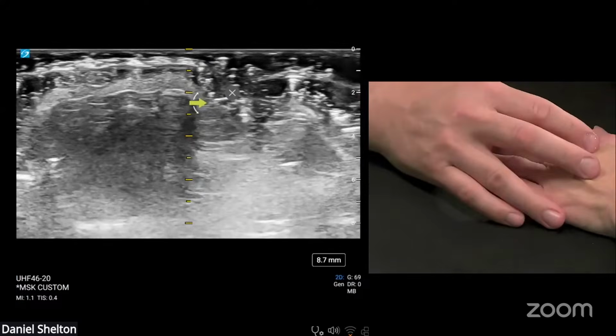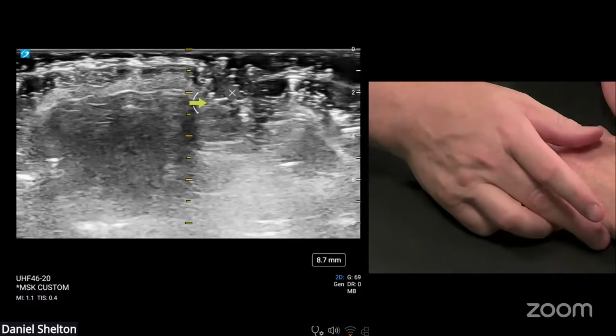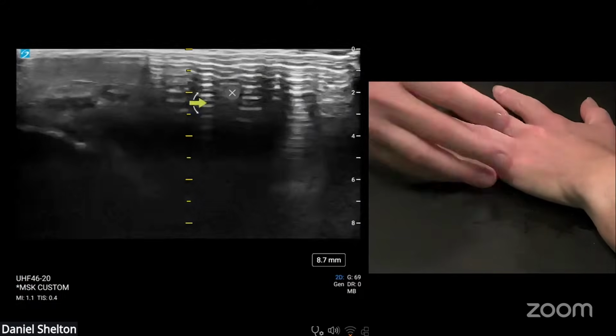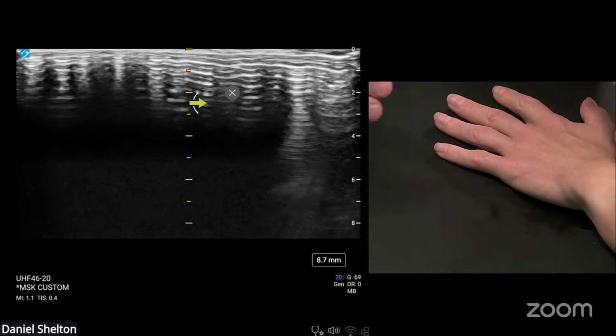You know, we did not get a chance to go in depth on the nerves, and I do plan on having a follow-up session on nerves. So I would say just the scanning technique involving small tubular structures like nerves is pretty much always the same.